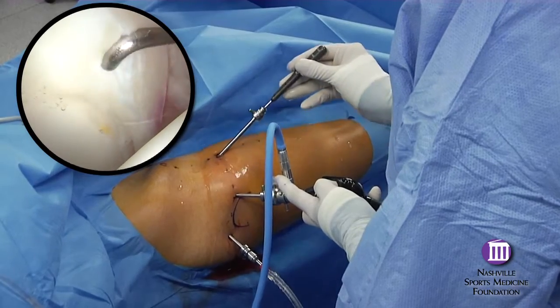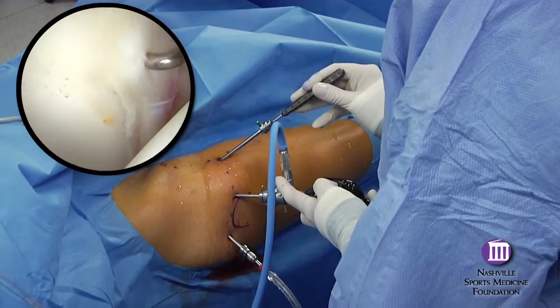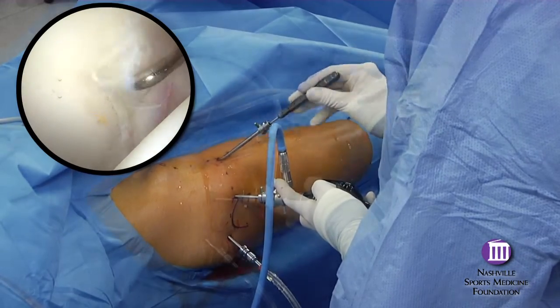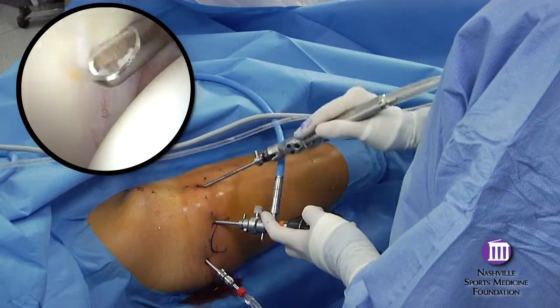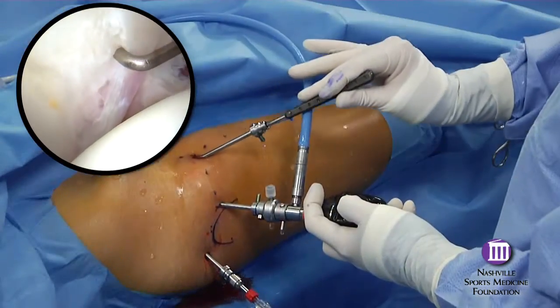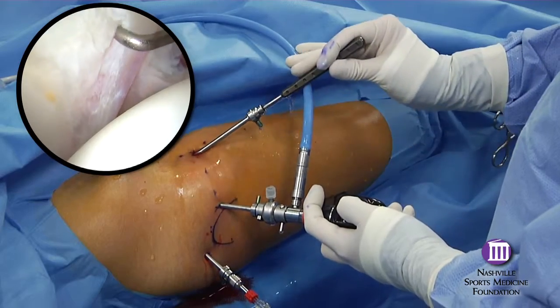Use of the modified anterior portal is illustrated in this anterior labral repair. The standard anterior portal provides the greatest utility for access to the central compartment and for most instrumentation along the anterior aspect of the acetabulum.